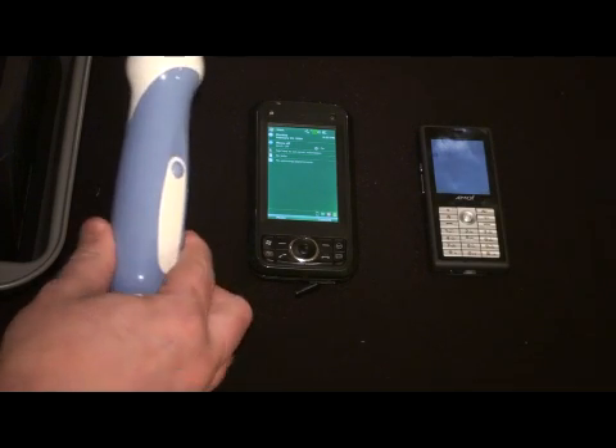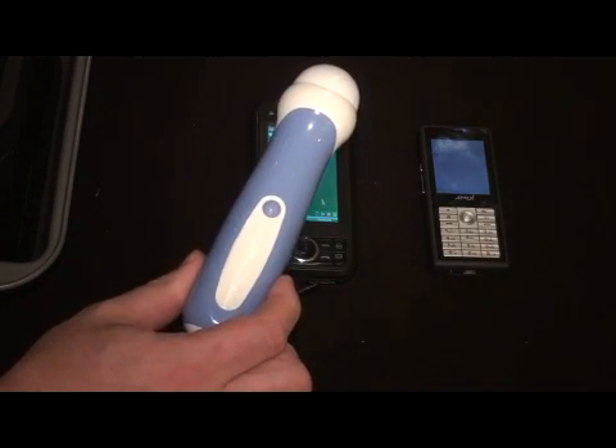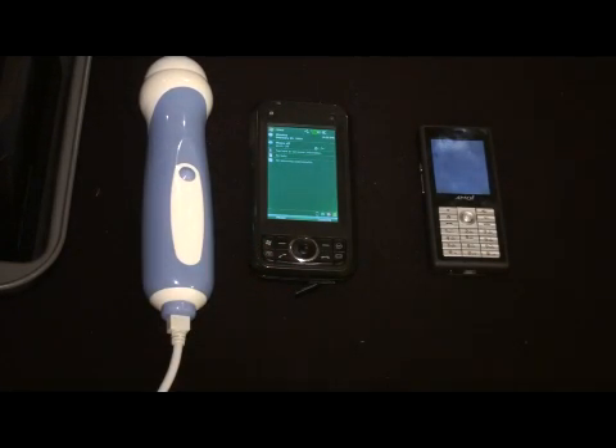What we have here is a standard USB ultrasound probe. These are available commercially and have been for several years. FDA approved and CE marking approved.